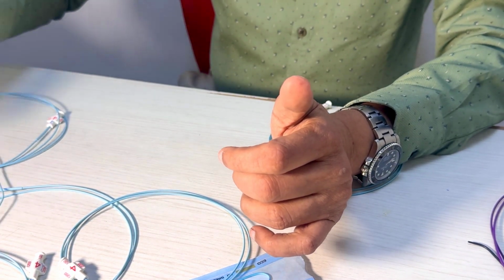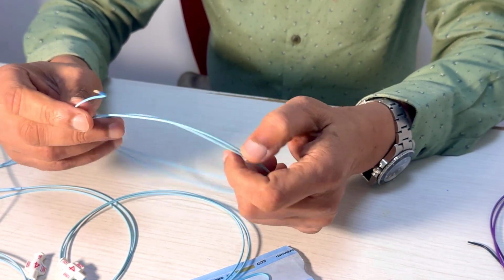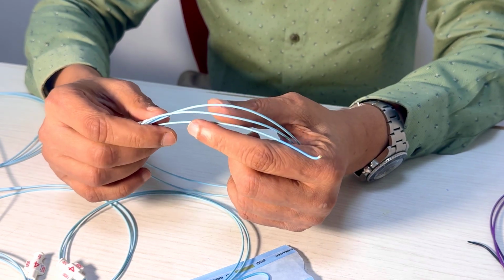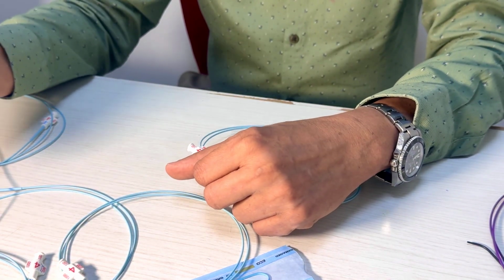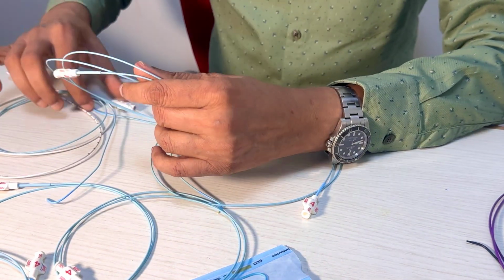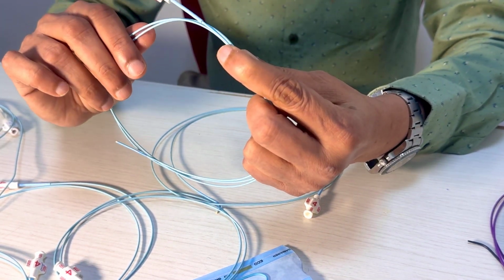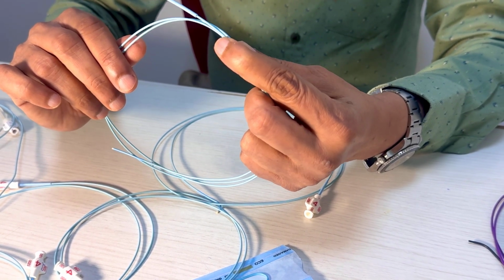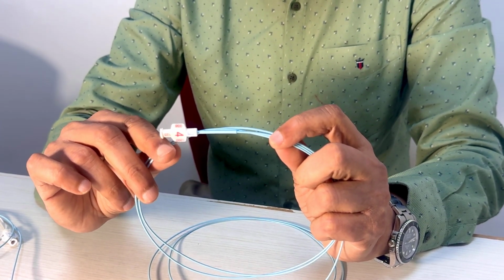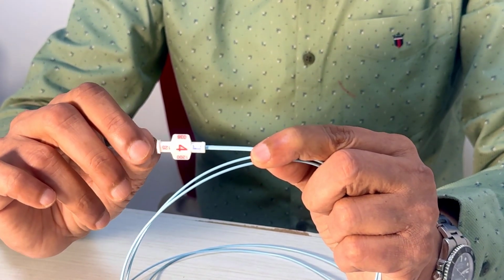For example, when you're working in the carotid, you take a catheter like a vertebral catheter, and you're trying to hook the vertebral artery. At the same time, you're taking a long sheath, which is 100 centimeters, and the catheter won't exit. So there you'll need a longer catheter, like the 125 cm multi-purpose catheter we showed you here. Today you have all catheters in different lengths. For example, you can have a vertebral catheter in 125. You can get a catheter used even for transradial, which are all 125. So the first marker that you need to understand is the marker which tells you the length.